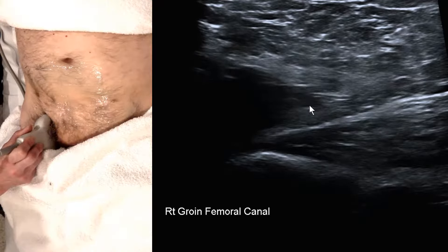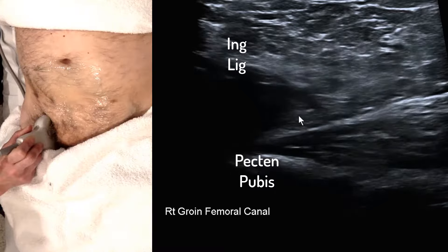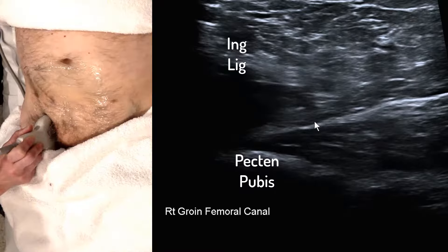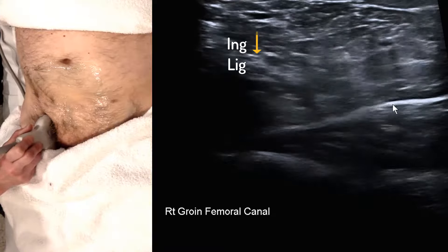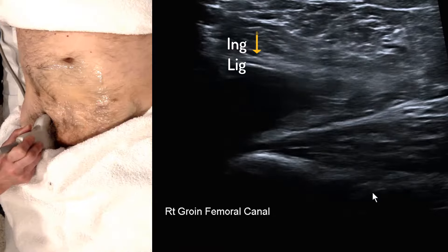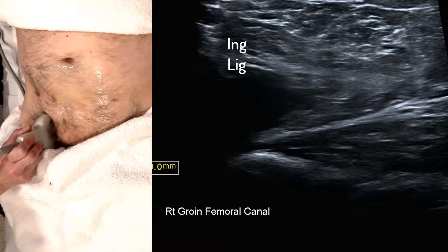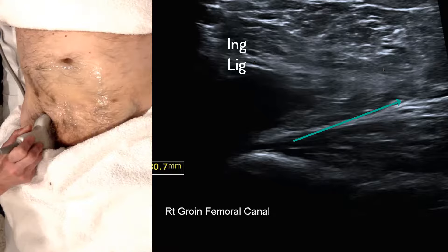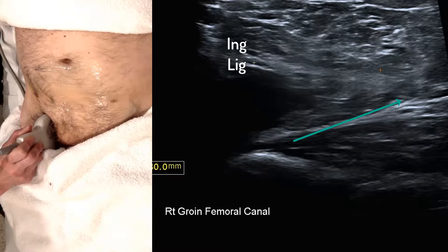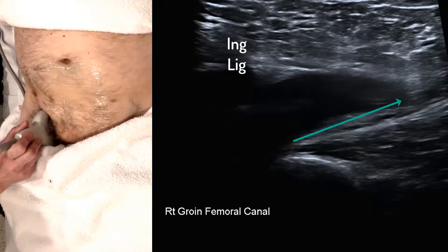We expect to see some movement at the level of the pelvic rim, but not down to this level, which would indicate significance — particularly if you use the inguinal ligament as your landmark. If it's moving south towards the SFJ, so not at this level, then it's significant.